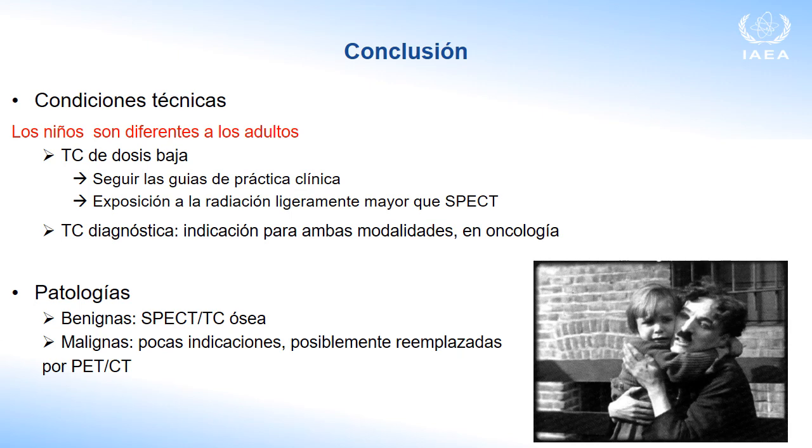In this case, the exposure to the radiation is a little bit higher than the single SPECT. If we consider the diagnostic CT, this is only in cases where the indications are similar, in oncology essential.